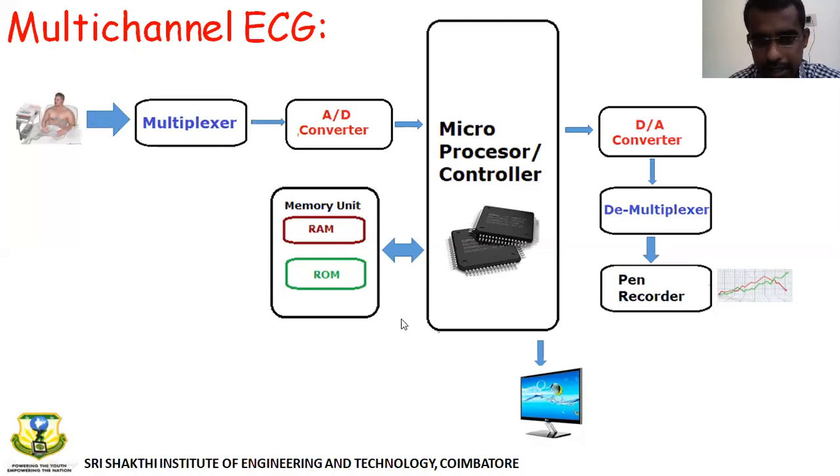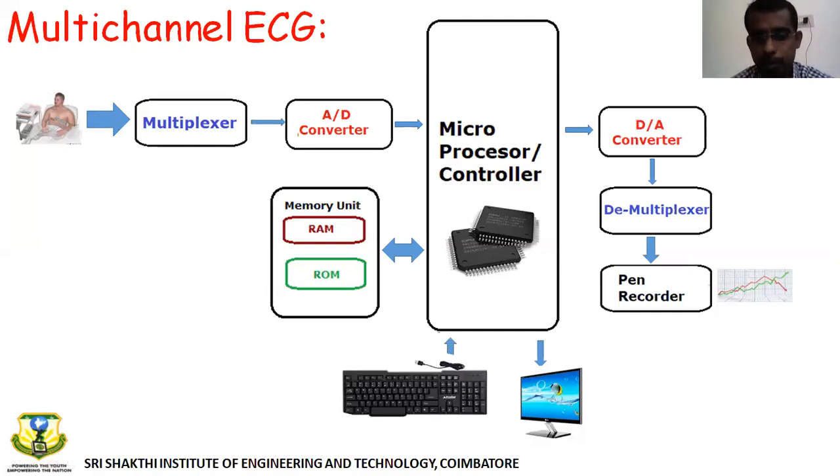Other than that, there is an input device too, a keyboard. Whenever you want to change the program, you need to attach an input device like a keyboard, and then you can reprogram it. Or even when diagnosing or troubleshooting some problem, you need an input. That's why you have a keyboard here.